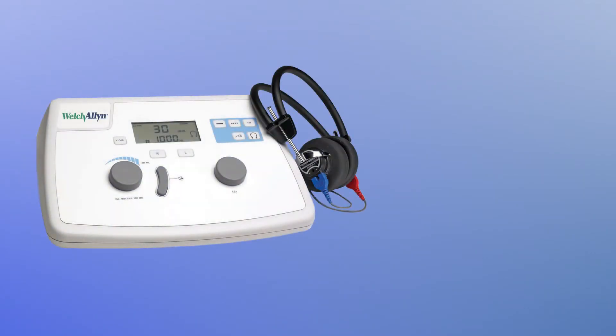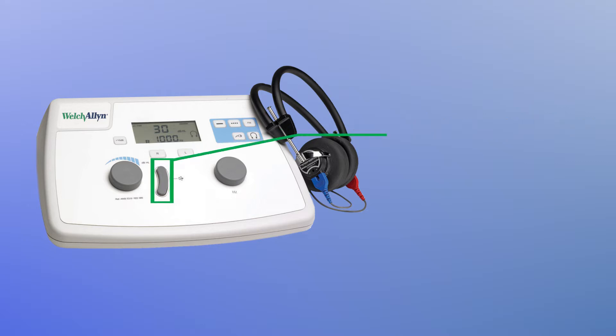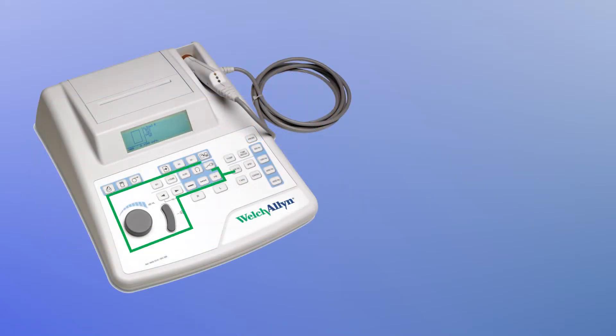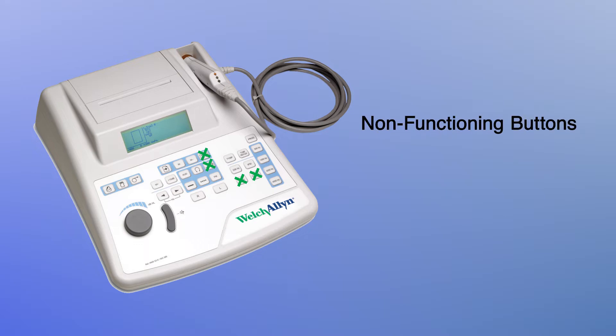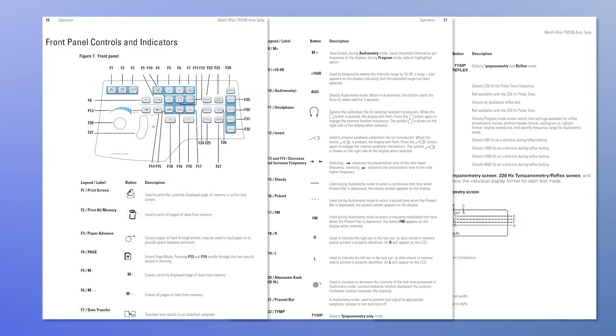Here's a quick overview of the buttons on the AM282 Audiometer. Here's a quick overview of the buttons on the TM286 AutoTymp. The directions for use included with your device includes a full reference section for the device buttons.